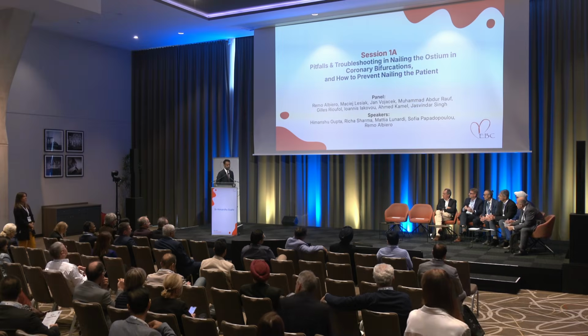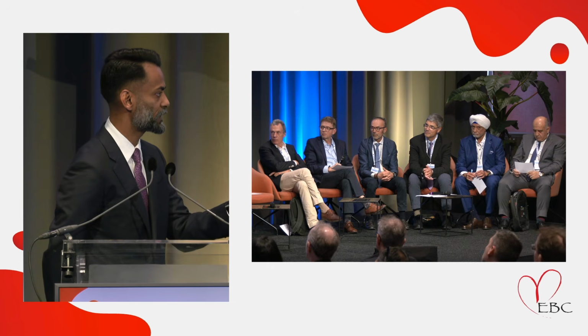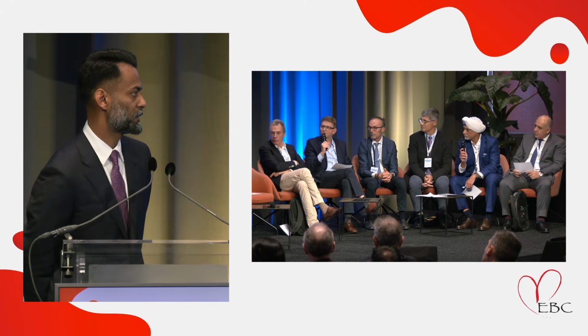Yeah, just because there were so many stent struts lying there, which would be just hanging around the ostia, we thought probably it's better to cover them with a stent rather than a DCB. But there was not much disease on the IVUS on the circumflex ostium, so a DCB might have worked. Because it was a large vessel, we decided we'll cover the left main and do a proper POT so that if he comes back later, it would be easier to treat. But DCB might have worked, as you say. Okay. Thank you so much.